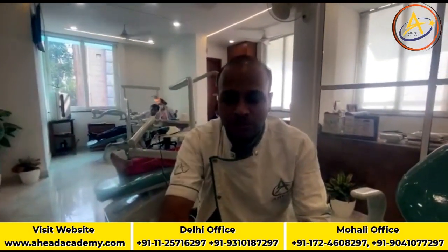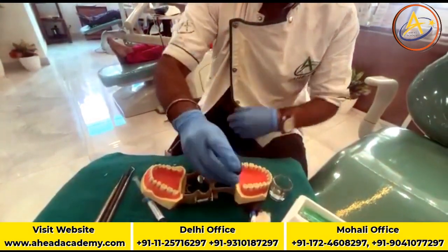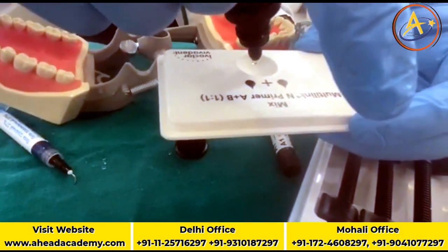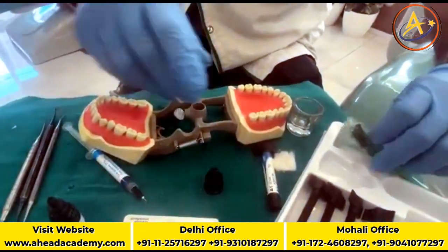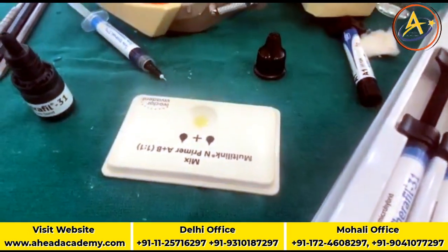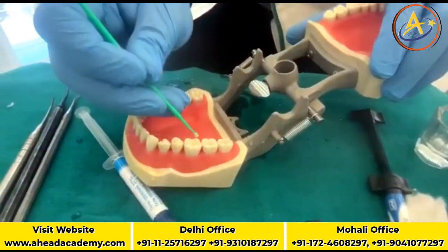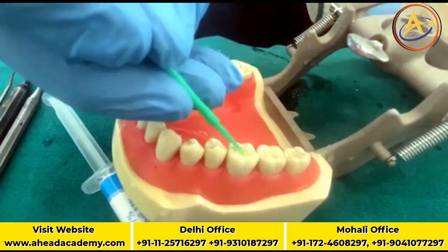Now, how to apply a bonding agent? Take the bonding agent, always shake it, and after shaking, open the bottle and just take one drop of bonding agent. This is right. Now always take a fresh applicator tip and dip it. So see, one drop is so much bonding agent. And then you have to apply it onto the tooth surface.